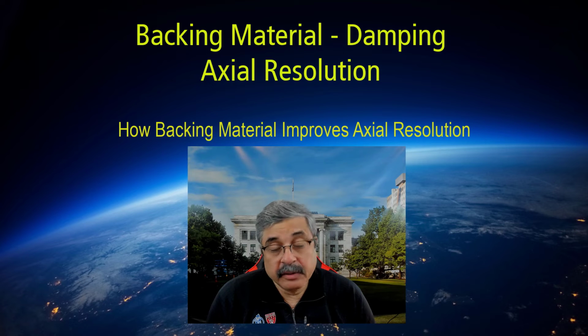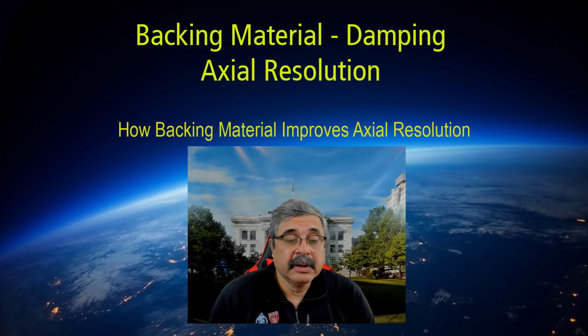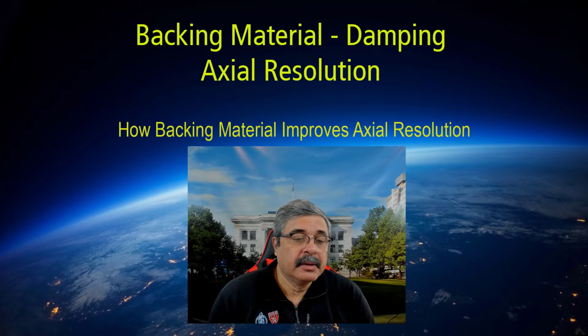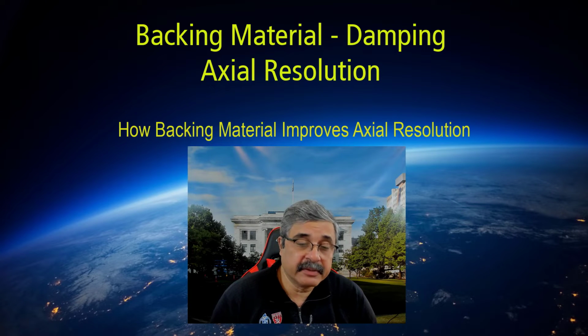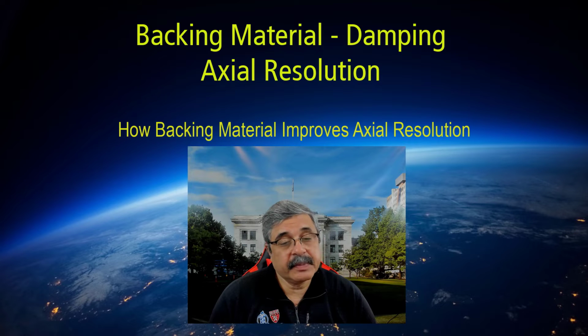So in this lesson, we will go over the transducer design in general and the purpose of backing material in particular in the ultrasound transducer. This is a very important concept, understanding of the backing material, because that results in prevention of ringing of the crystals that leads to shorter spatial pulse length and eventually improved axial resolution.